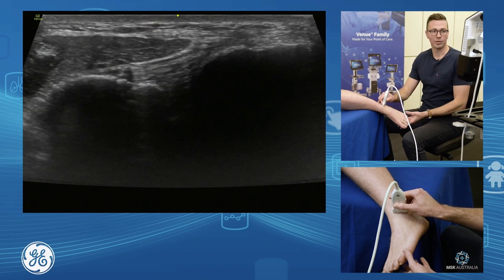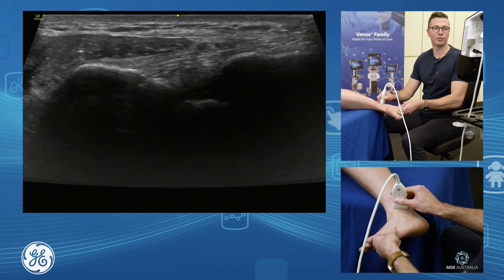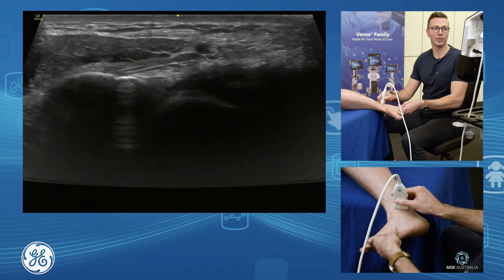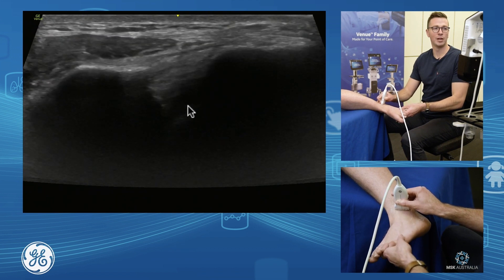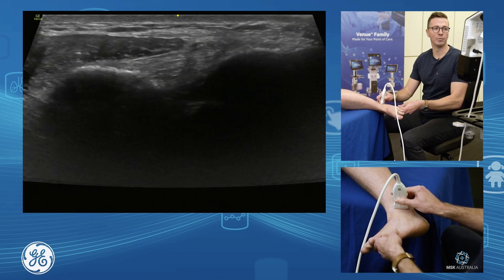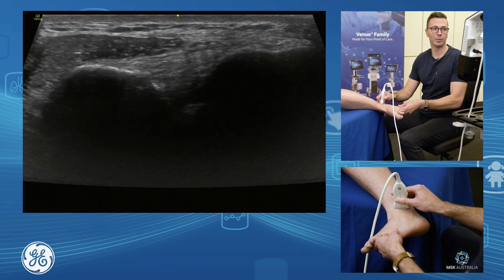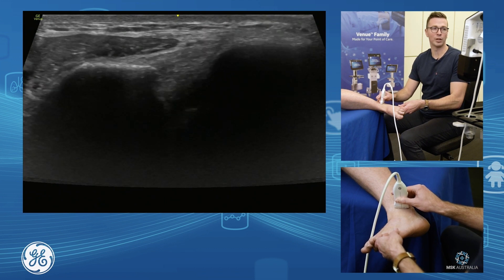To stress this ligament and see it a little bit nicer, we add a little bit of dorsiflexion. Dorsiflexing the foot forces the talus up and forces the tibia and fibula to separate away from each other. This is a nice assessment of our anterior inferior tibiofibular ligament for your high ankle sprain assessment.